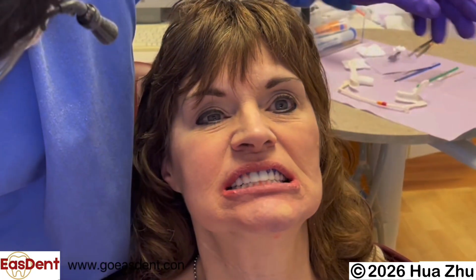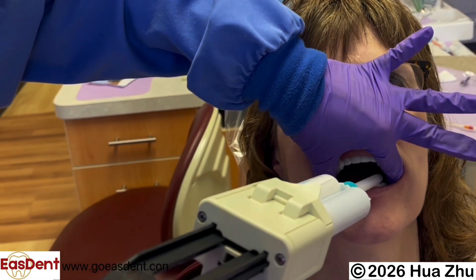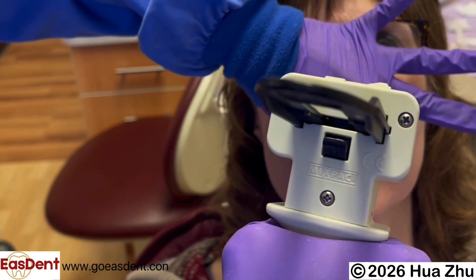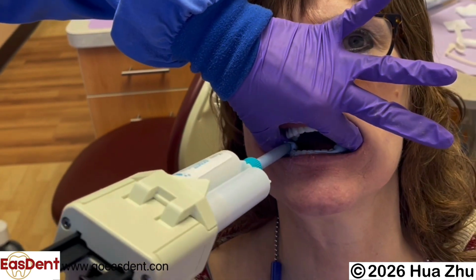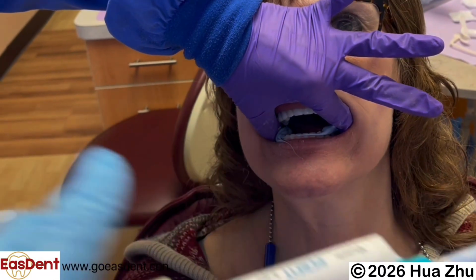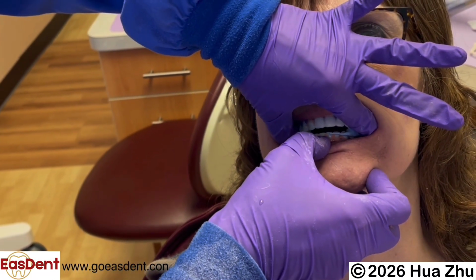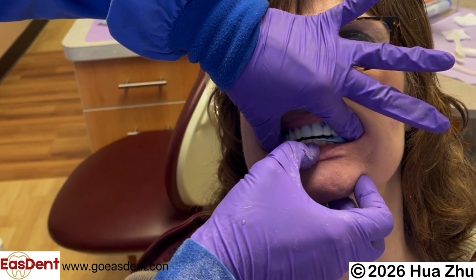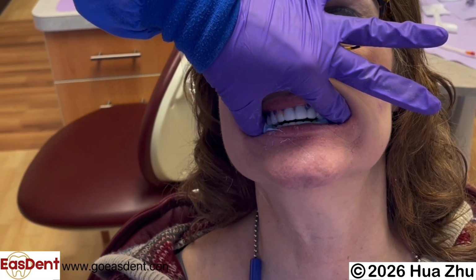However, errors may occur during the procedure. If there is a discrepancy between maximum intercuspation and the centric relation, you need to use bite registration material to record the centric relation. Load bite registration material on the occlusal surface of the mandibular Easdent teeth. If you have a good VDO, guide the patient's jaw into centric relation. Let the patient bite down until the first area just touches.